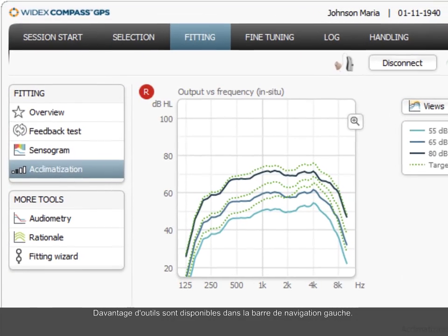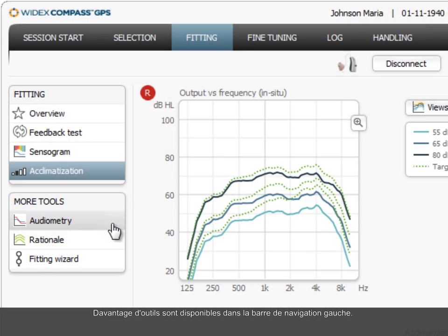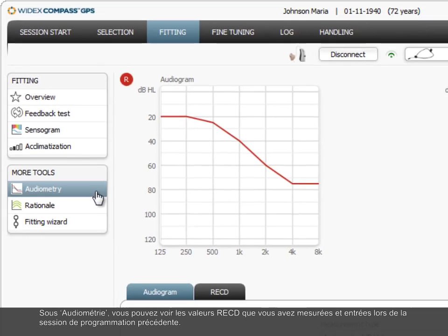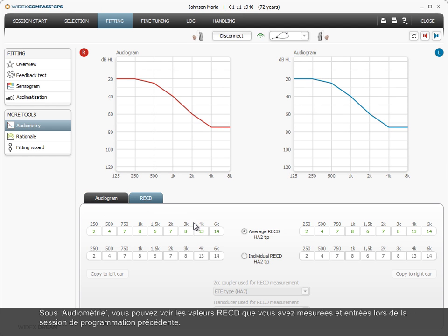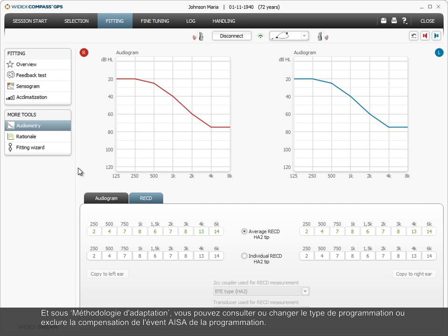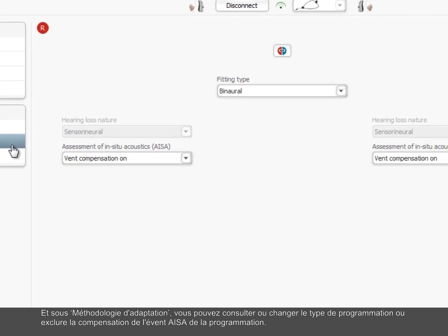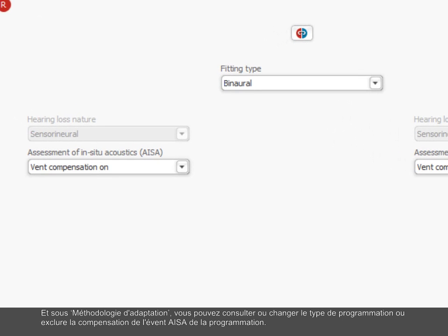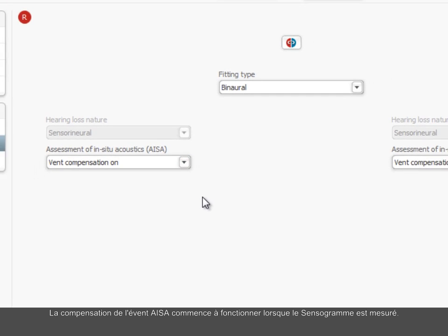More tools are available in the left navigation bar. Under Audiometry, you can see the RECD values that you may have measured and entered earlier in the fitting session. And under Rationale, you can see or change the fitting type or exclude the ISA vent compensation from the fitting. The ISA vent compensation starts to work when the sensorgram is measured.